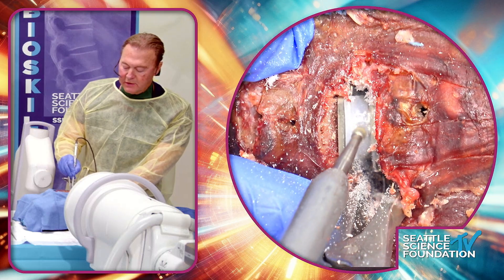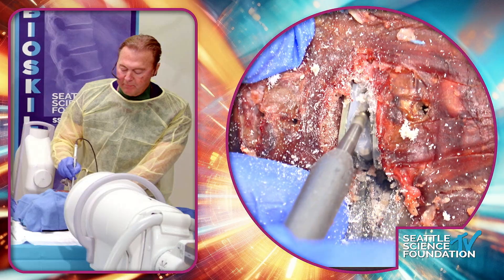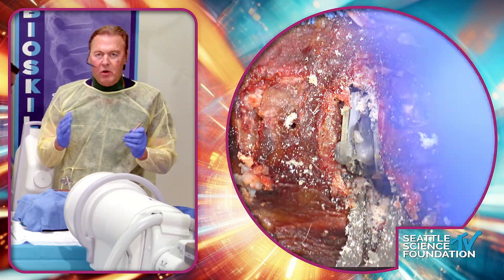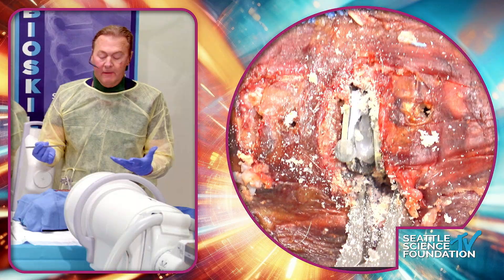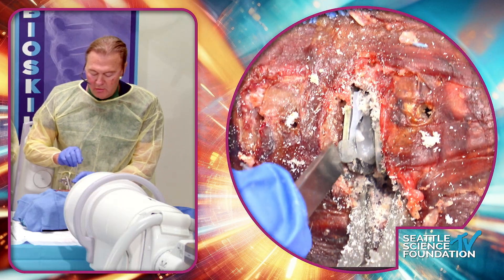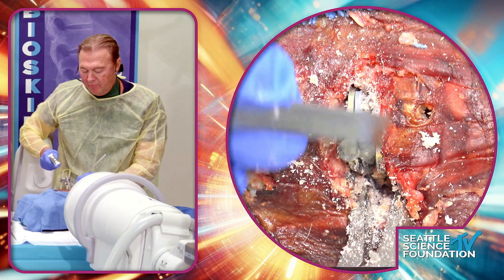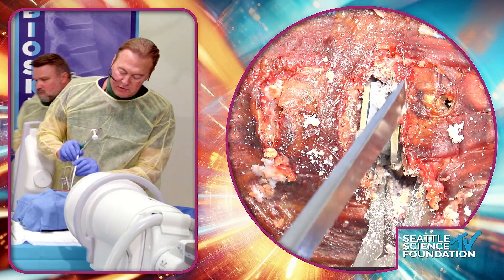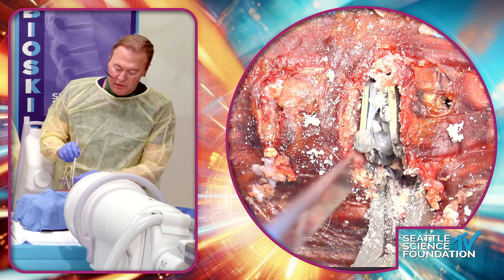I take the drill, irrigate, and cut the dome off — because trying to explant straight out with the removal device is very difficult, typically. Even when you disarticulate it from the bone, if the dome is there it's still very resistant. The key is the osteotome: put a narrow osteotome in with one or two taps and the whole end plate will disarticulate. I do both sides and then turn it a little to disarticulate — you're not trying to cut bone, just getting into that plane between the bone and the metal.